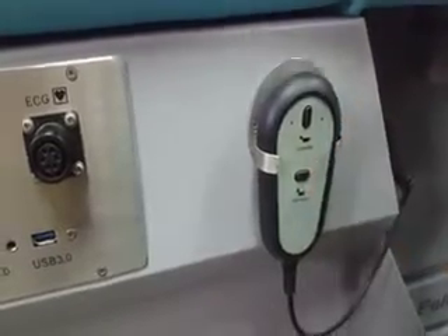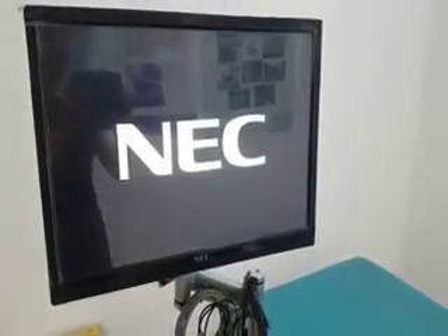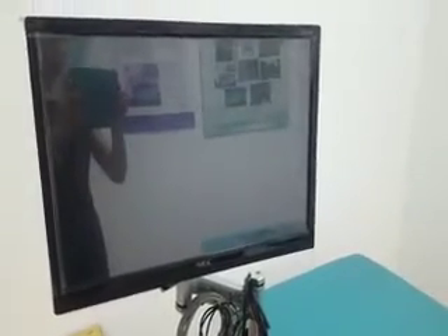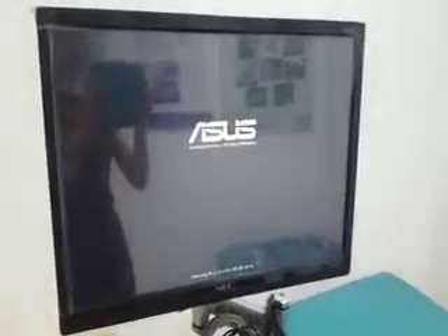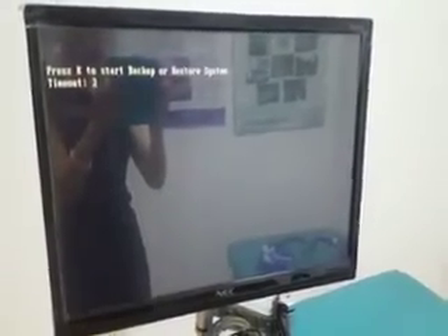To start treatment, first turn on the main power switch and the computer switch. Let's look at the screen monitor — the welcome interface of Yumen Medical Instrument Company, ECP MC3, is now displayed.